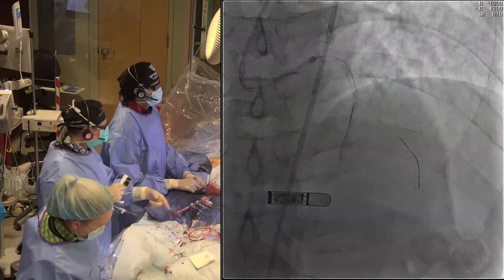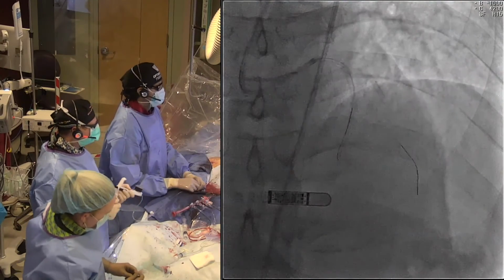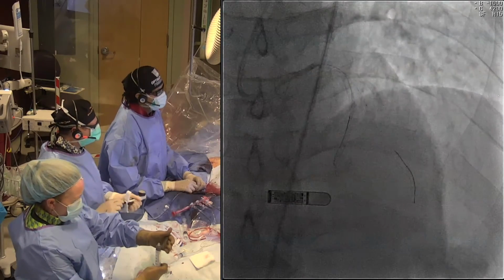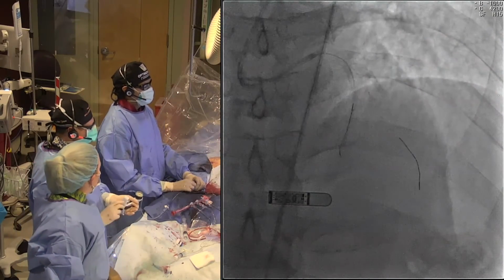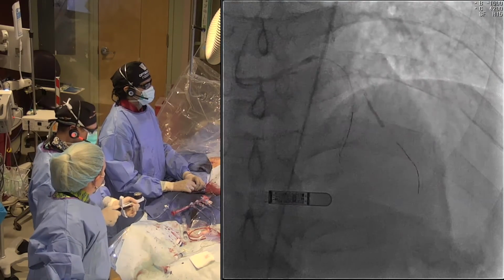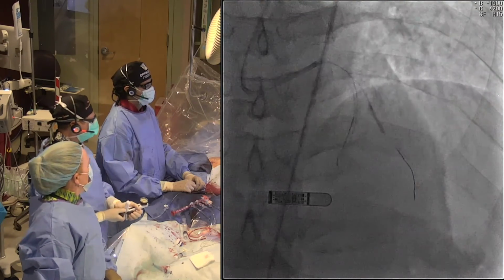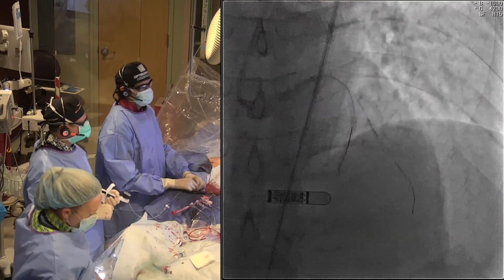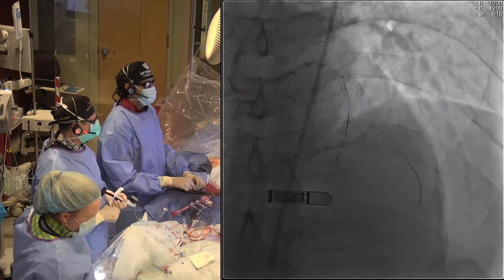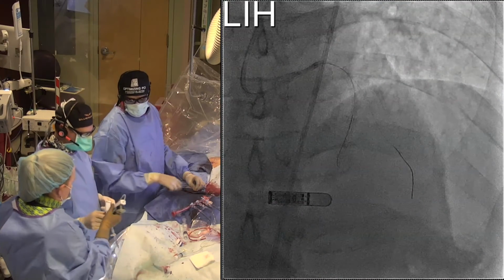Did that progress from last time, this diag lesion? No, it was there before. It was there before? Yeah. Okay, very smooth. All right, so let's... I mean, I think we might even be able to deliver the stent without it. Really? Yeah. Okay, just don't strip it off. Okay. That's all. And down. 14 for 9. And honestly, if I don't have to mess with it, I'm not gonna. I think, honestly, I'm a little concerned. Let me try. Okay. Can I have a 2.5 by 15 stent? Was it a 15 balloon? Yeah.